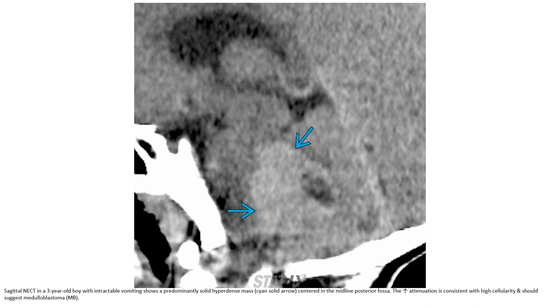Non-contrast CT in a three-year-old boy with intractable vomiting shows a predominantly solid hyperdense mass centered in the midline posterior fossa. The increased attenuation is consistent with high cellularity, which should suggest medulloblastoma.